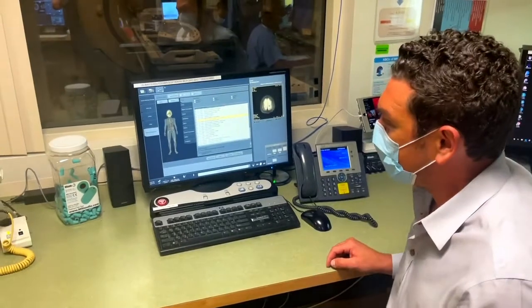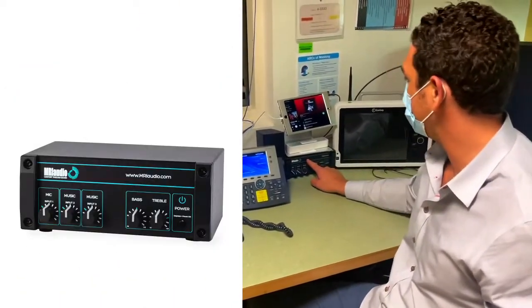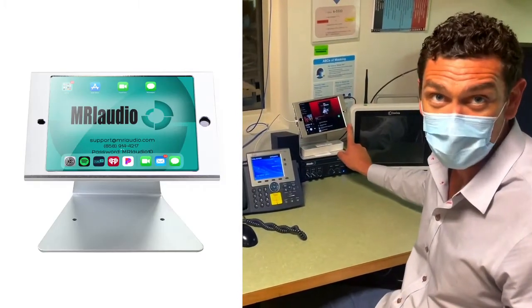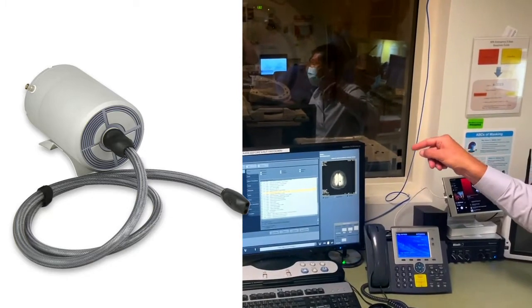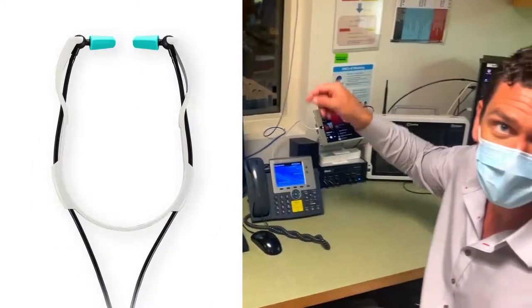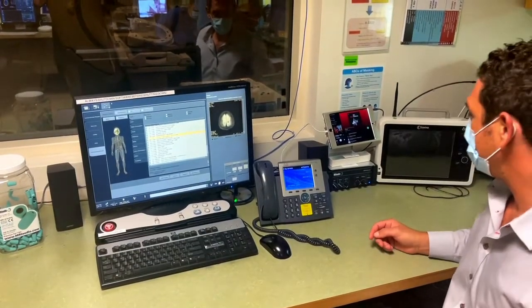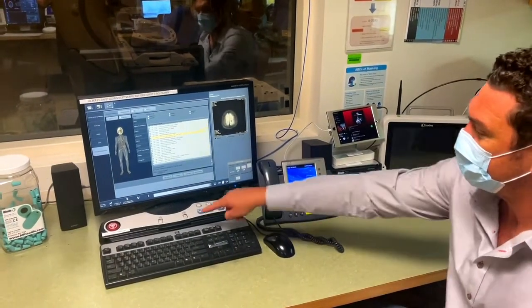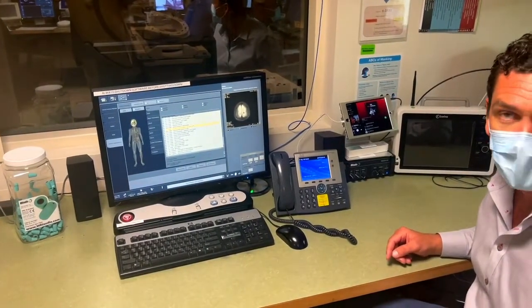For GE magnets, the MRI audio system comes with technologist speakers, a digital amplifier, an iPad that acts as the music source, an audio transducer, pneumatic tubing, over-ear headphones, and in-ear headphones that are inside the MRI suite. The MRI audio system has been designed to be easy to use and integrates the GE intercom directly into the patient headphones through the MRI audio system.